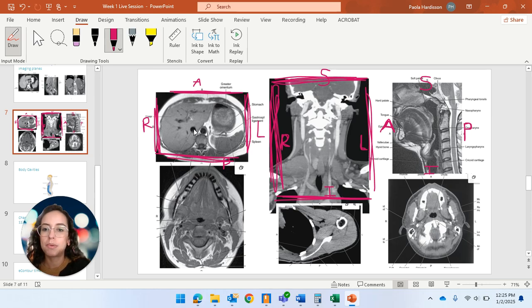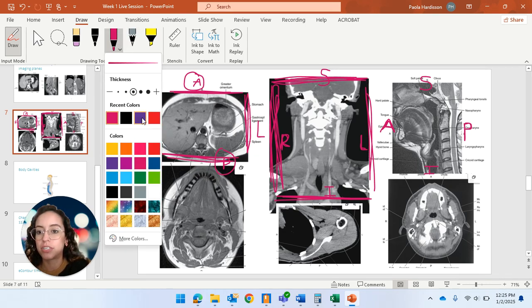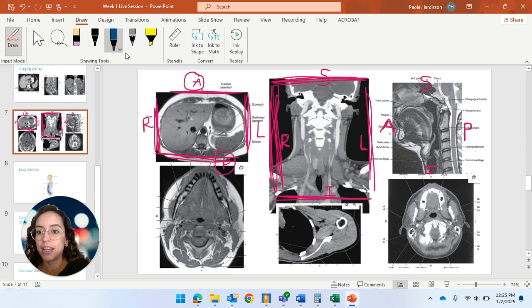So the anterior posterior direction, so these two together, those are known as vertical shifts. So this is a table vertical shift. Anterior, posterior is vertical direction, the Z direction, dimension. Right and left, so let's pick a different color. Right and left, these are known as lateral shifts.